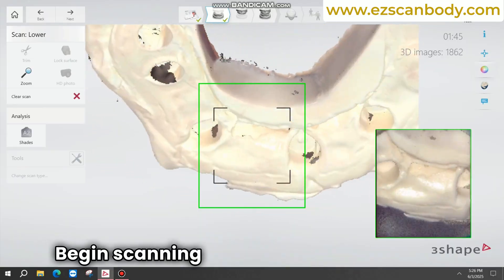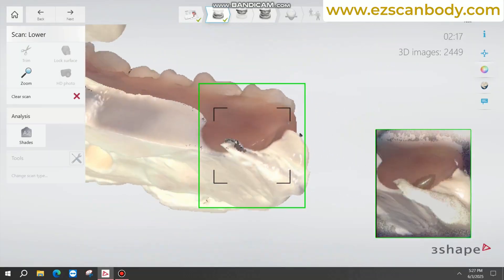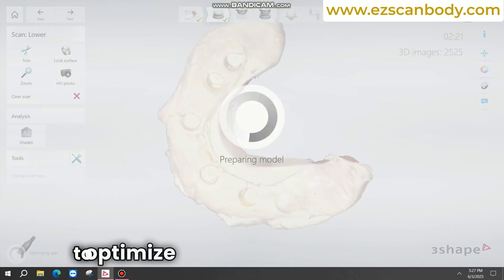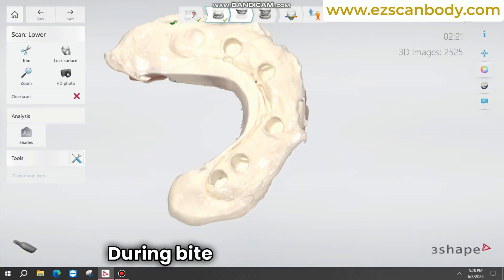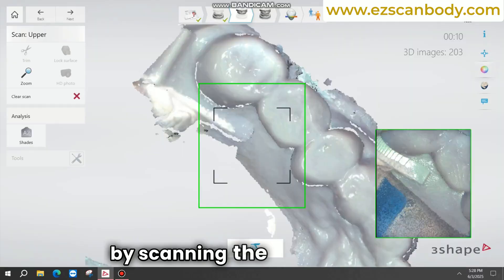Begin scanning from the intaglio side and proceed to scan the top part of the denture. Clean the buccal side to optimize scanner capture during bite scanning. Scan the opposing arch followed by scanning the bite.